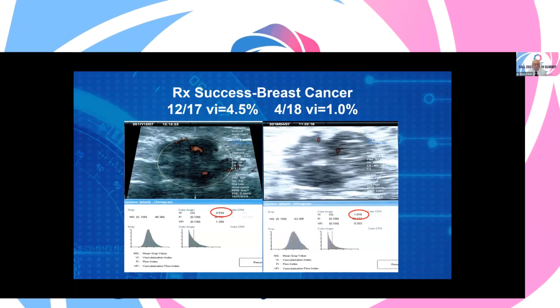This patient was done in December, treated. Notice that while it's hard to see the red vessels on a single picture, the 3D ultrasound gives you a whole volume of the tumor at once. Now, this is important because if you're treating something, you can take the volume of the tumor and stick the ultrasound 3D information into an MRI machine, and you can guide needles to go right into the area that's aggressive. So you have a way of doing image-guided treatment at the same time.